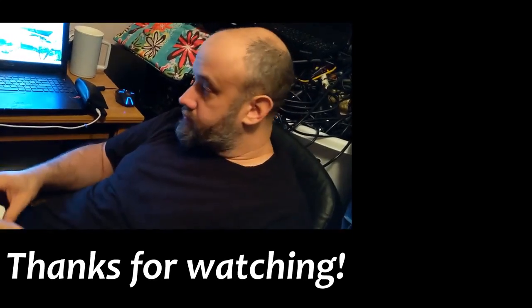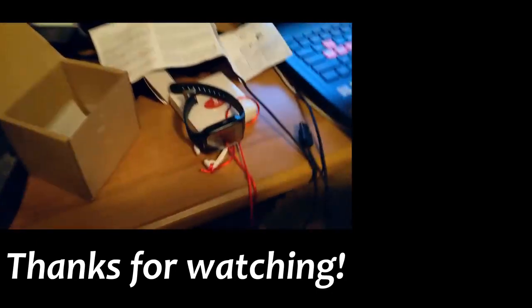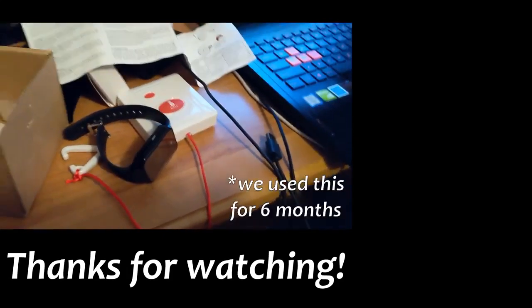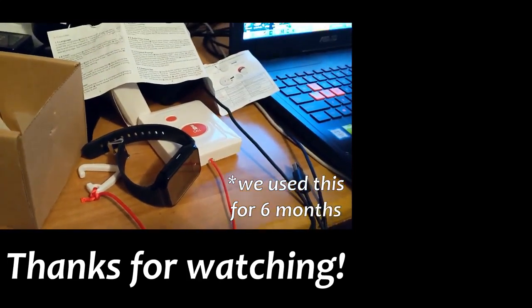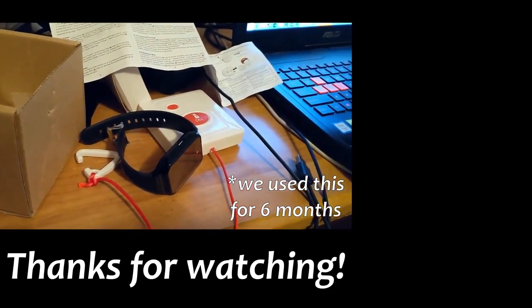It was way less expensive than other options, so if you are willing to put up with the fact that it has some kinks - it did technically work for the duration that we've had it - but we are not going to be reinvesting in this at this time. Maybe there are other options on the market that are better than this, but I would not recommend this to other people at this point.